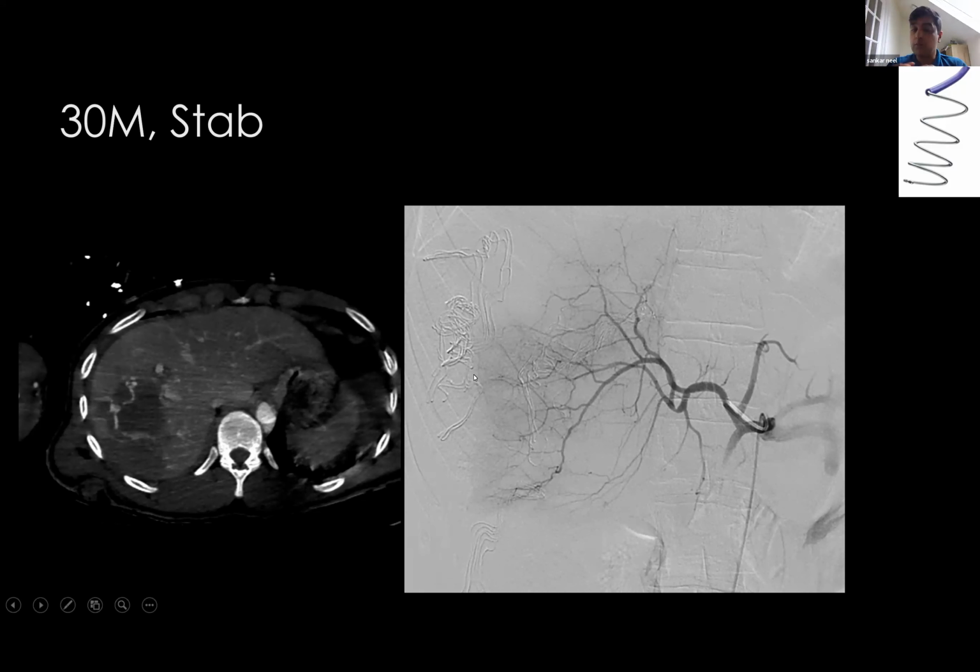This patient went into surgery because he was extremely unstable. So all of these radio-opacities that have been subtracted are gauze, surgical gauze swabs that have been packed. And the patient went back and started being unstable again, stabilized for some time.